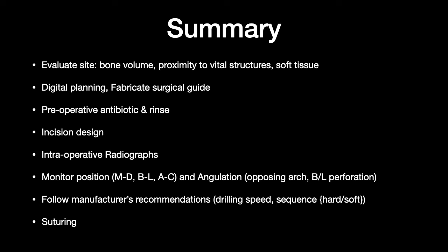After evaluating the CBCT and the clinical impression, we go ahead with the digital planning, use our software to place the implant on the CBCT and position it appropriately, preferably fabricating a surgical guide to help in placement and angulation of the implant. This will reduce the surgical time and reduce errors. Pre-operative antibiotics and chlorhexidine rinse are advisable. Incision design needs to be taken care of. Some practitioners would prefer a papilla preservation technique. Others do the sulcular technique. It depends on the situation, honestly.